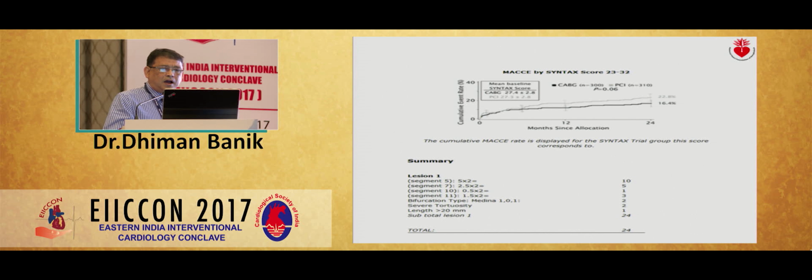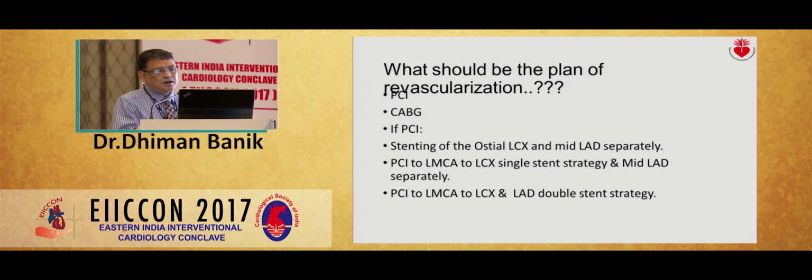Actually, I had not done the IVUS pre-PCI. I have done the IVUS post-PCI. In doing this case, as the patient has chest pain and a SYNTAX score around 24, I made an attempt to do a PCI. In doing a PCI for this patient, the following points came to my mind: stenting of the ostial LCX and the mid LAD separately.